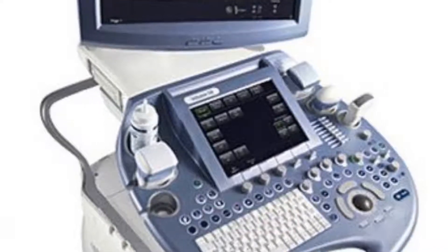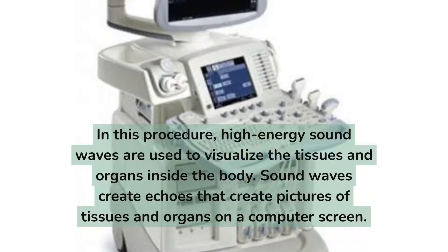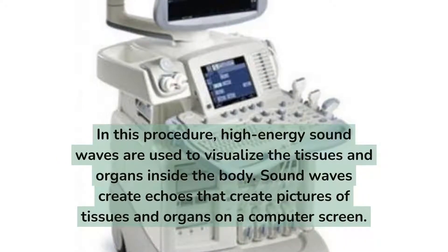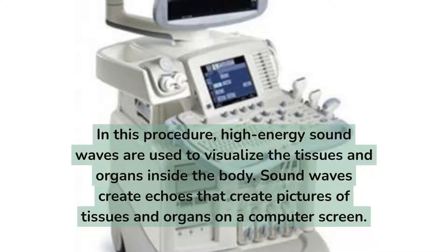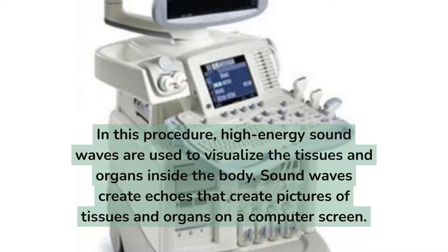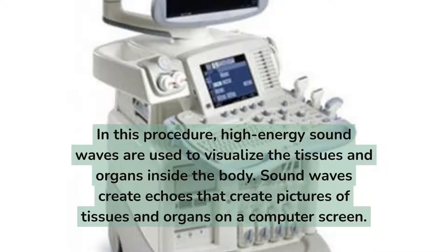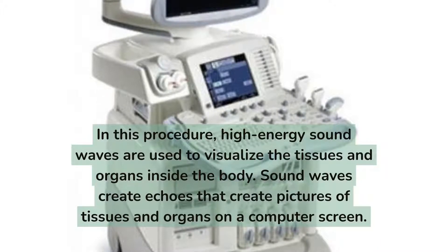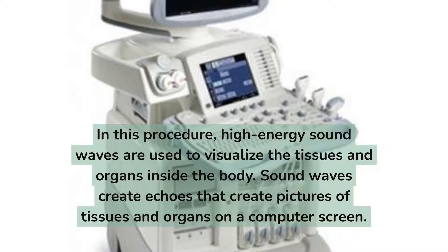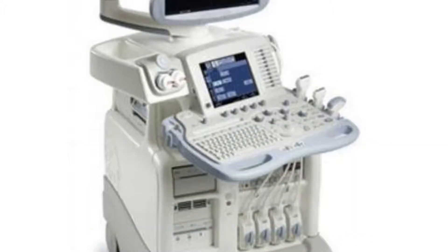What is ultrasound? In this procedure, high-energy sound waves are used to visualize the tissues and organs inside the body. Sound waves create echoes that create pictures of tissues and organs on a computer screen.